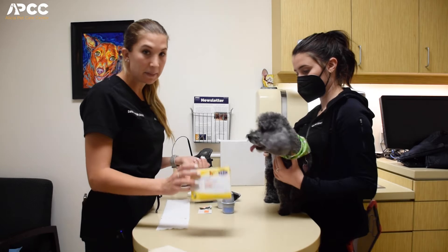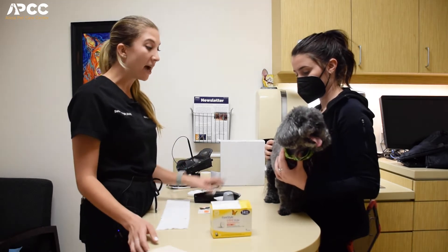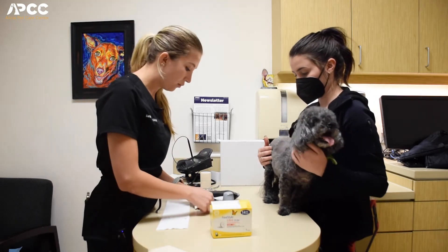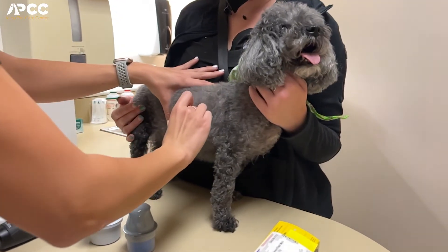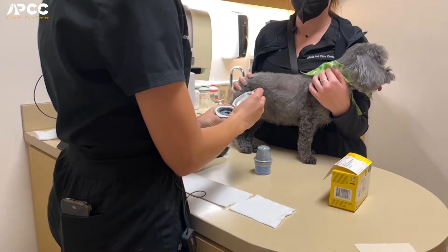A couple things come in this pack and that's something that we do apply here in hospital. We have already shaved the site for her — we just clip it down with some clippers — and then we're going to scrub the area with alcohol. Once the area is clean, that's when we will go ahead and start applying the sensor.